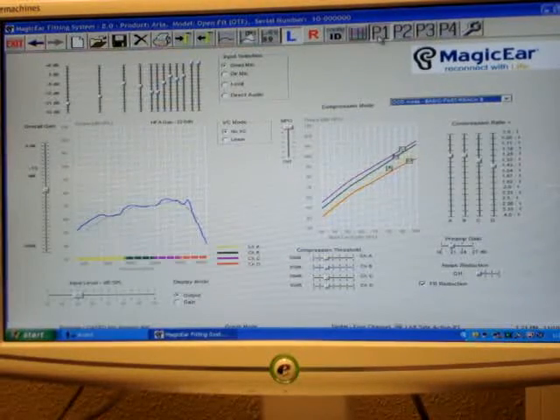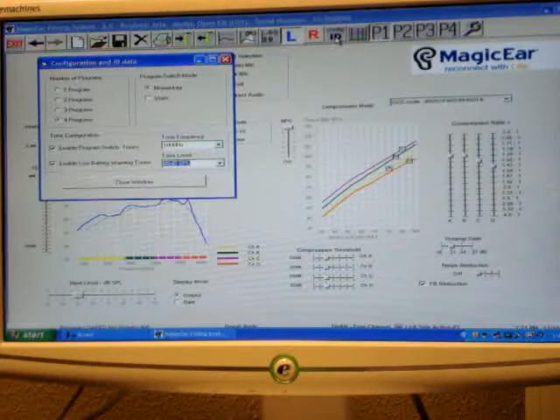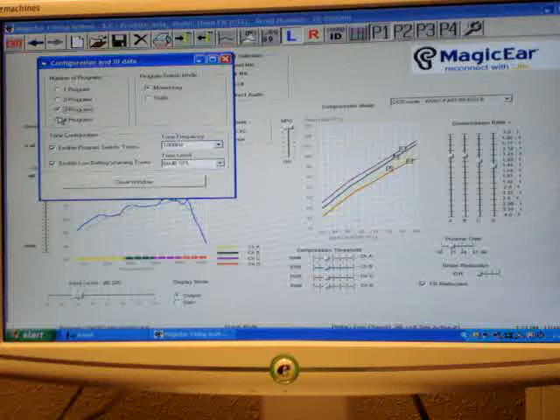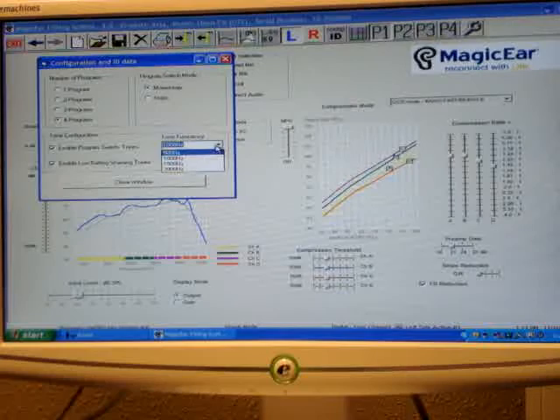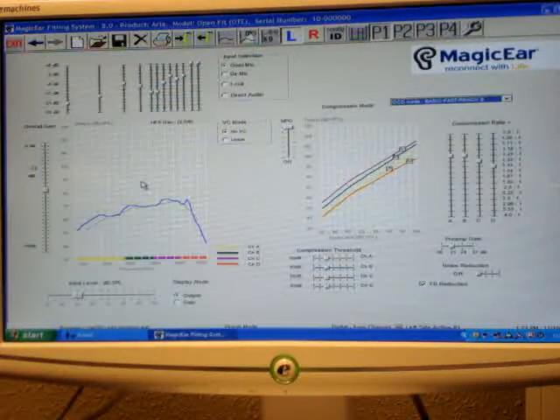Now here, P1, 2, 3, 4 indicates programming number 1, 2, 3, 4. This is the auto fit. Your config ID opens up a new screen, so you can enable whether you want 1, 2, 3, or 4 memory programs. You can change the frequency and tone where the memories will beep, and also the low battery. So if the battery is getting weak, it will beep. So you can adjust all of those settings and close the window.